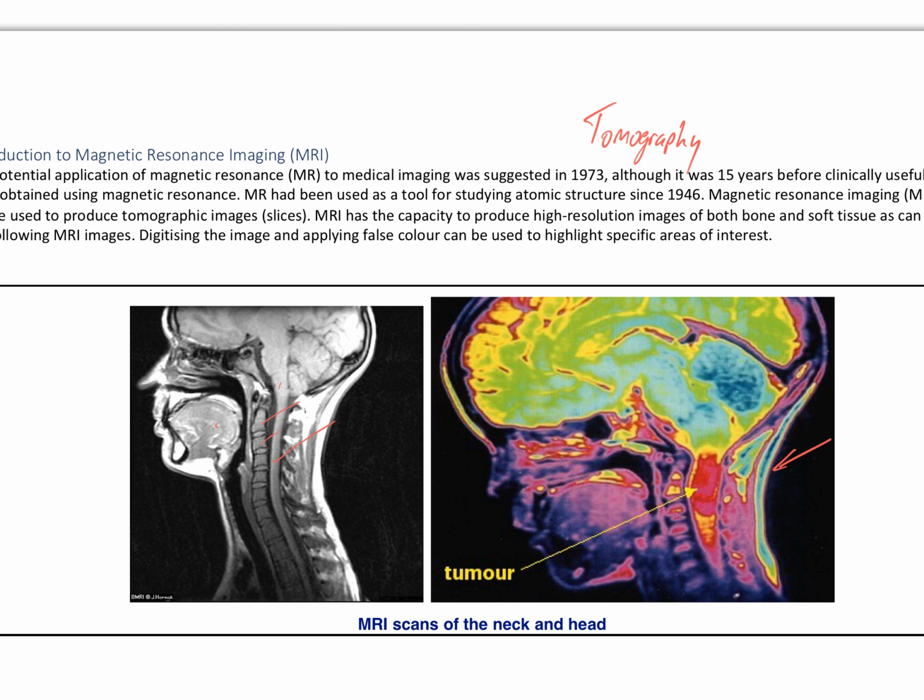So we're not relying on radiation from outside passing through the body, as in the CAT scan using X-rays. This one uses the magnetic field to affect protons and neutrons in the body, and it also uses radio waves to cause them to release a little bit of information or energy themselves that we can then trace and image.